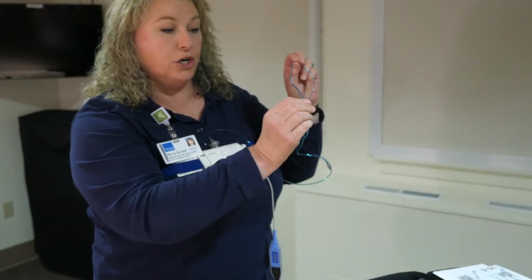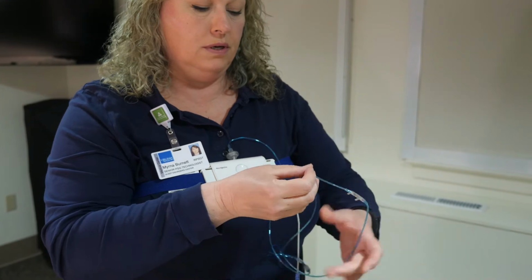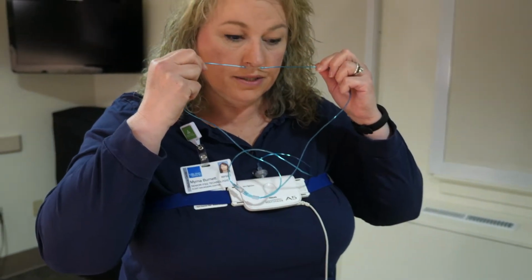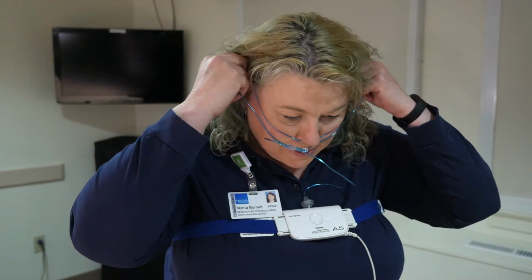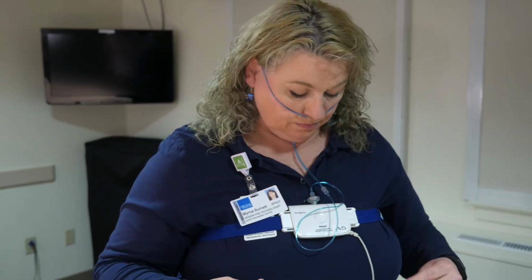The prongs to it are curved. I don't know if you can tell, but they're curved. When you put it in your nose, you want to put it in so that it's curved going down towards you. The prongs just slide into the end of your nose. The tubing goes up and around your ears and down under your chin. There's a little toggle on here. You just cinch it up so that the tubing is secure.